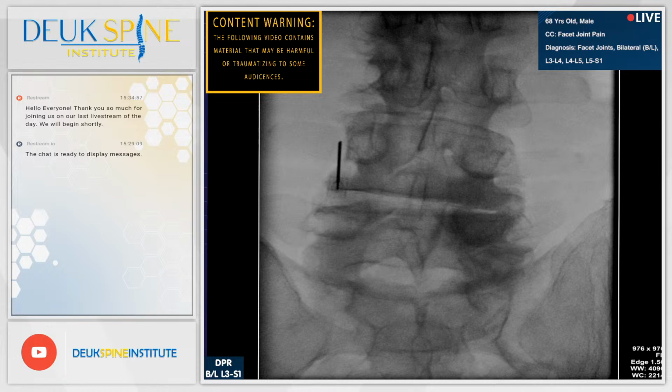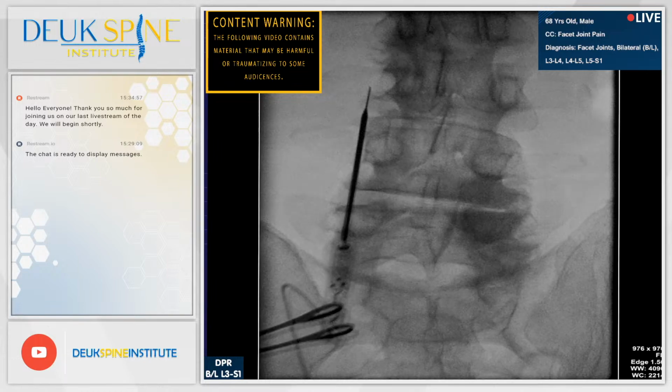All right, so Luis, good job using the skin traction technique. Perfect. You can see the tip. Jordan, show the audience how the tip of the probe is sitting right over the transverse process. Exactly where we want to be. Our target.